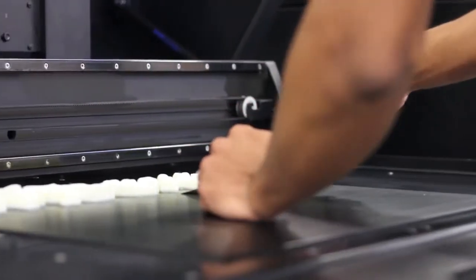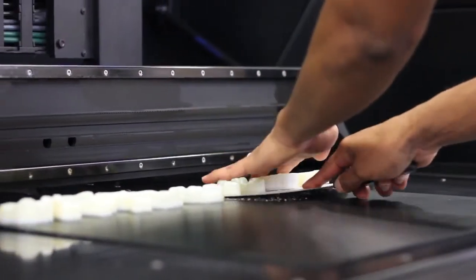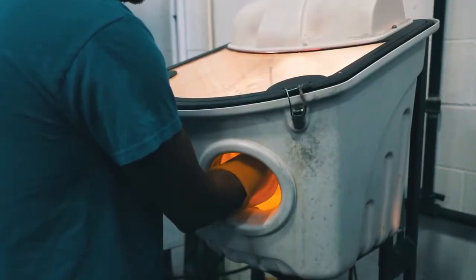Once your print job is complete, parts are quickly removed from the build tray. A water jet system is then used to quickly remove support material from the model. This is the most simple and common method.